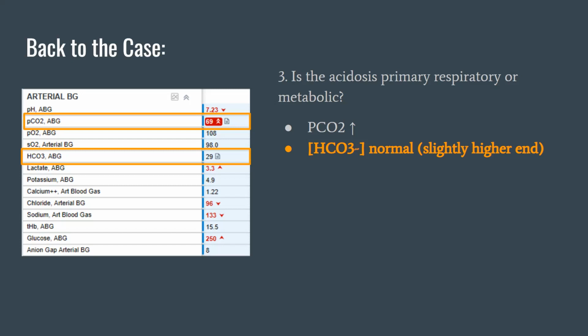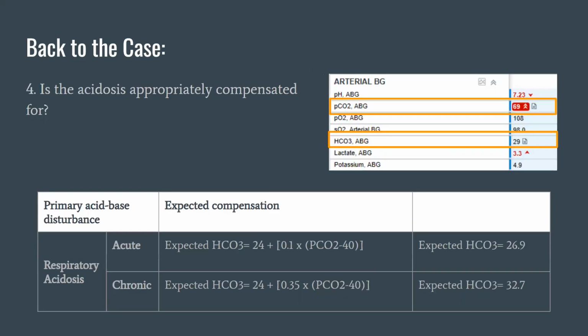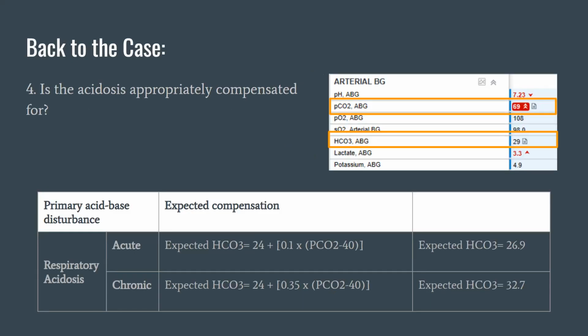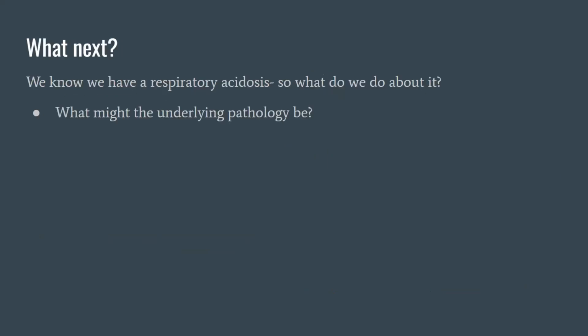Basically, our bodies have a harder time compensating for primary respiratory problems. That happens more slowly. So if it's an acute respiratory problem, you won't see as much compensation, versus if you have a metabolic problem, you can very easily change your respiratory rate and the compensation happens quicker. Okay, we're not going to go through whether it's compensated for, but I did run the numbers and it's somewhere in between, so it was a little bit confusing. But I think what's relevant is you see this ABG and you're like, that looks bad. What might be going on?